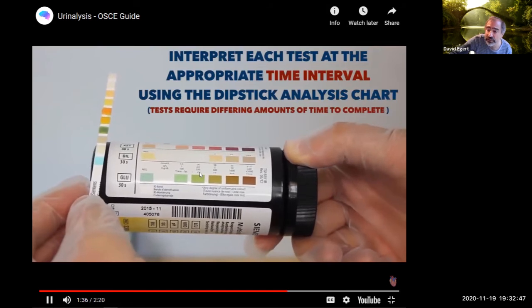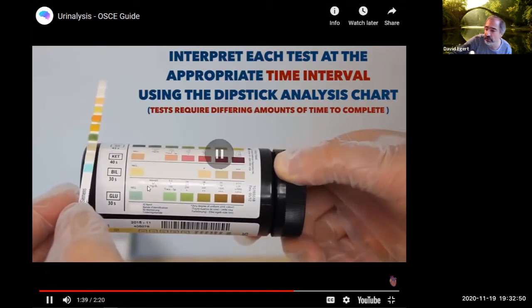There are different amounts of time, like 30 seconds, after which you can check glucose. In this square here, if it stays blue, that means negative. If there was glucose present in the urine, it would start turning green or brown, depending on how much. It's kind of hard to see here, but it actually gives you a quantitative measure of how much glucose, depending on what color this thing turns. Bilirubin is also after 30 seconds, ketones after 40 seconds, specific gravity after 45 seconds, other ones after 60 seconds.